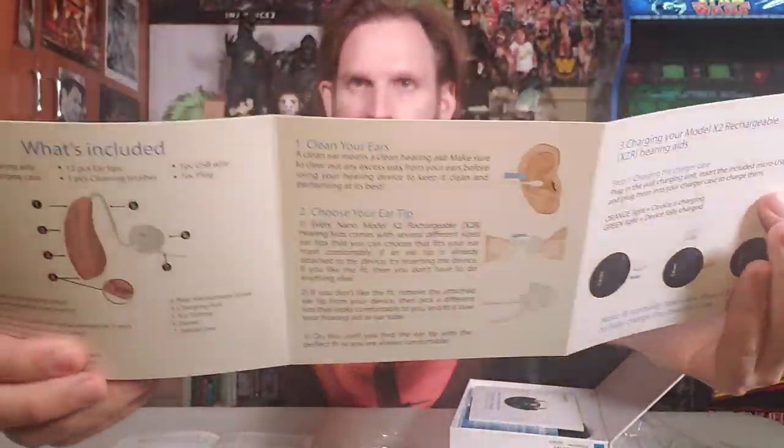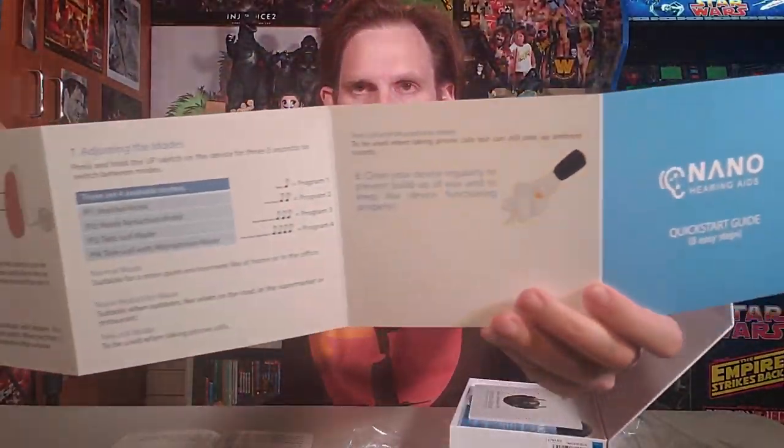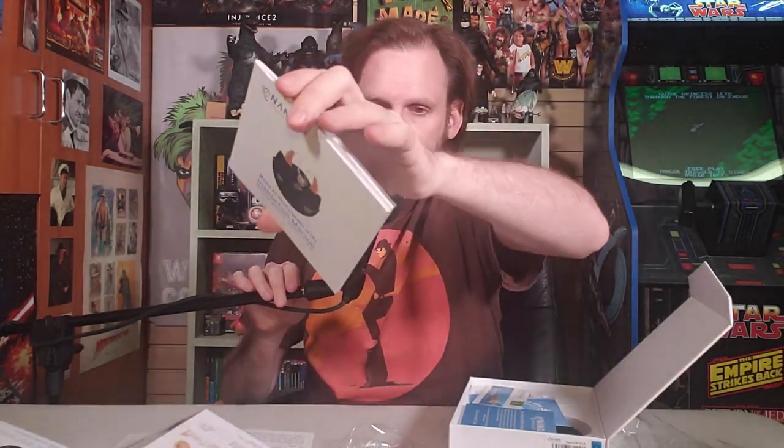We've got a quick start guide — it tells you what's included and walks you through what you're dealing with, what you're looking at. Hopefully you've consulted someone before you just start shoving things in your ears. Here's the instruction manual. It's thick — it's all in English, the whole thing is for the English-speaking and reading consumer.